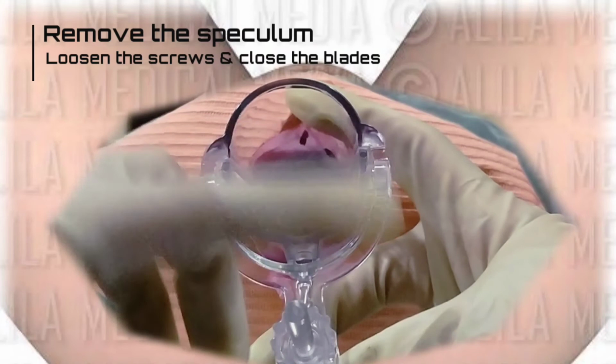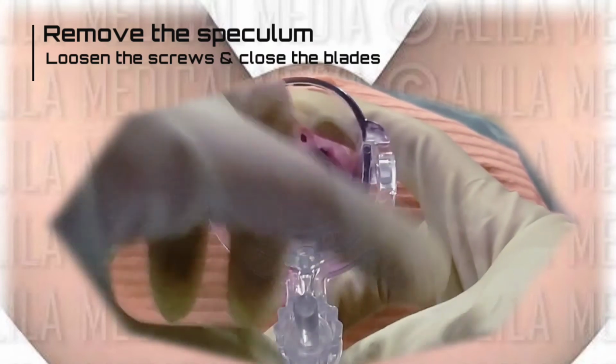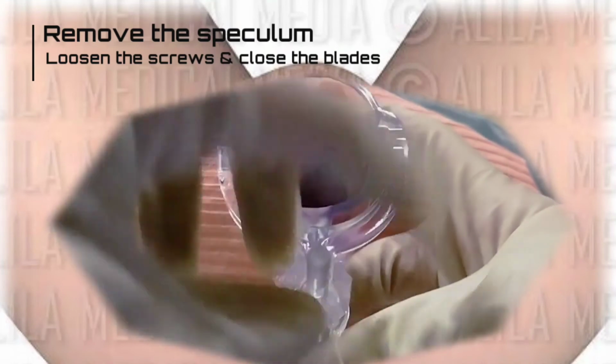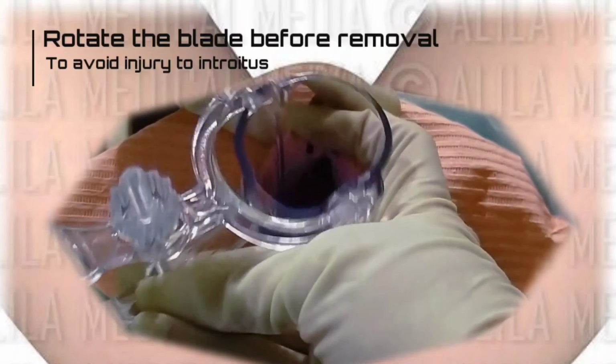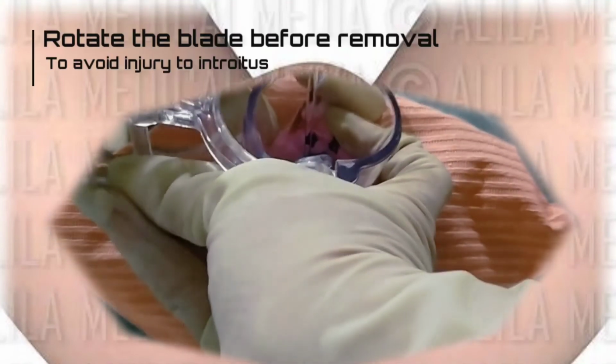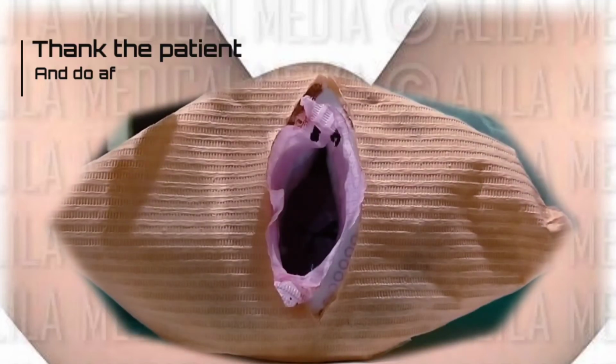Remove the speculum by loosening the screws and enclosing the blade. Make sure to rotate the blade before removal. Do aftercare.